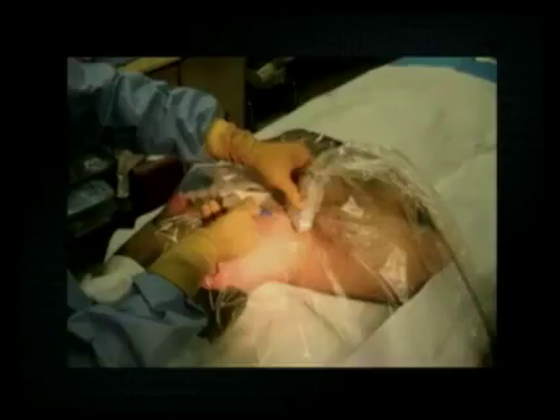Patient positioning remains the same for central venous access whether or not you're using ultrasound. But be mindful of where you place the ultrasound machine, because you will be using it in real time and you want a clear view of the screen while performing the central venous cannulation.